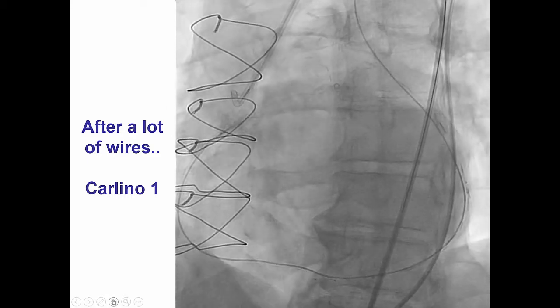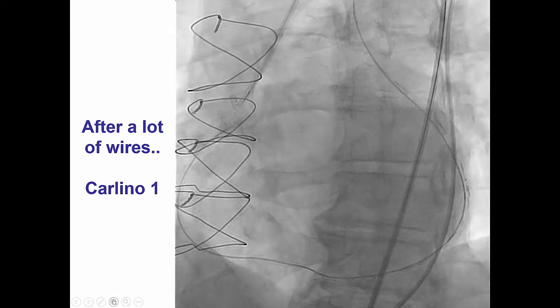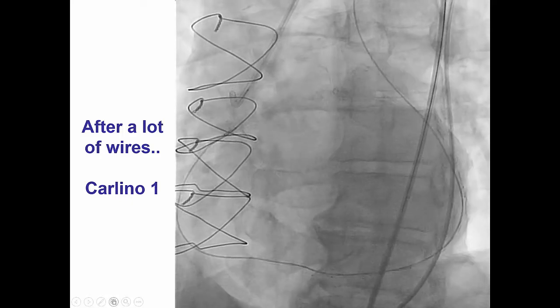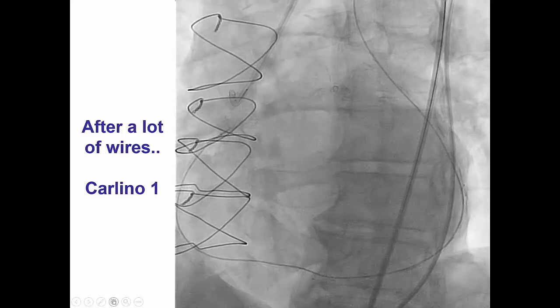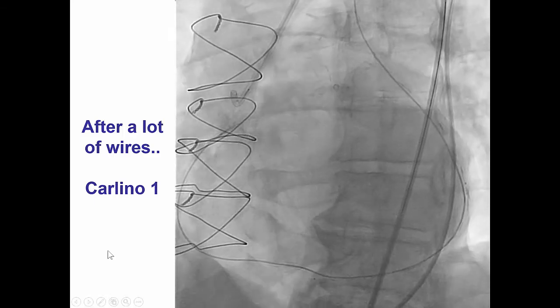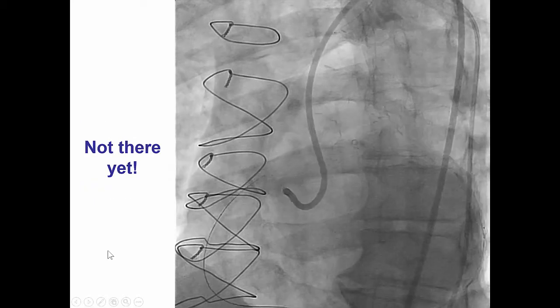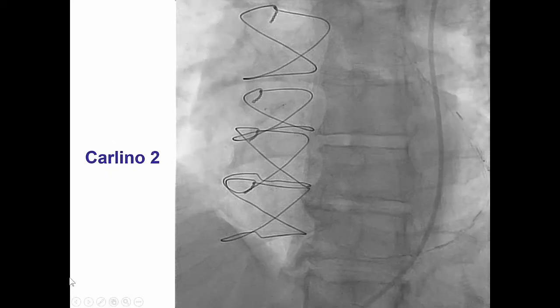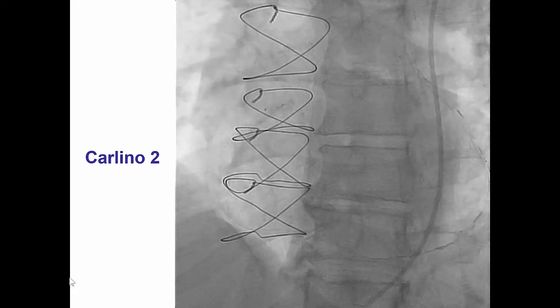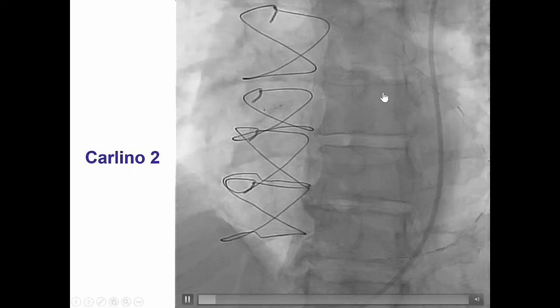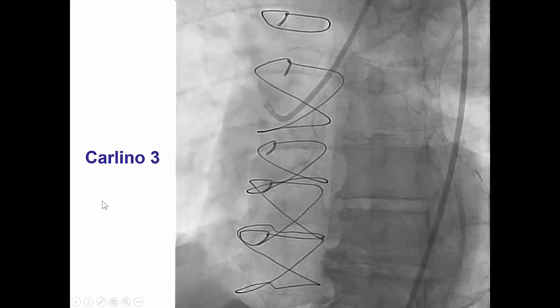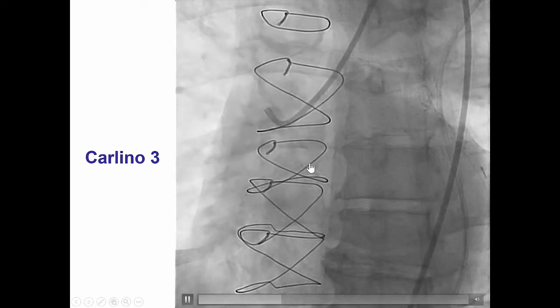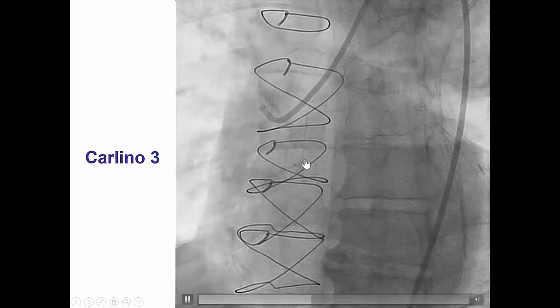We then used a technique called the Carlino technique, which is contrast injection through the microcatheter in an attempt to modify the intimal tissue, potentially cross some microdissections, and facilitate subsequent crossing. On the first injection there was not much flow of contrast. We tried again with guidewires but there was not much progress, although we are still within the previously placed stent. We tried the Carlino again, and there was some suspicion that some contrast may be reaching the aorta, but not quite yet. On the third attempt there was some feeling of a conus branch telling us we are going the right way, and we are very close to the tip of the stent.